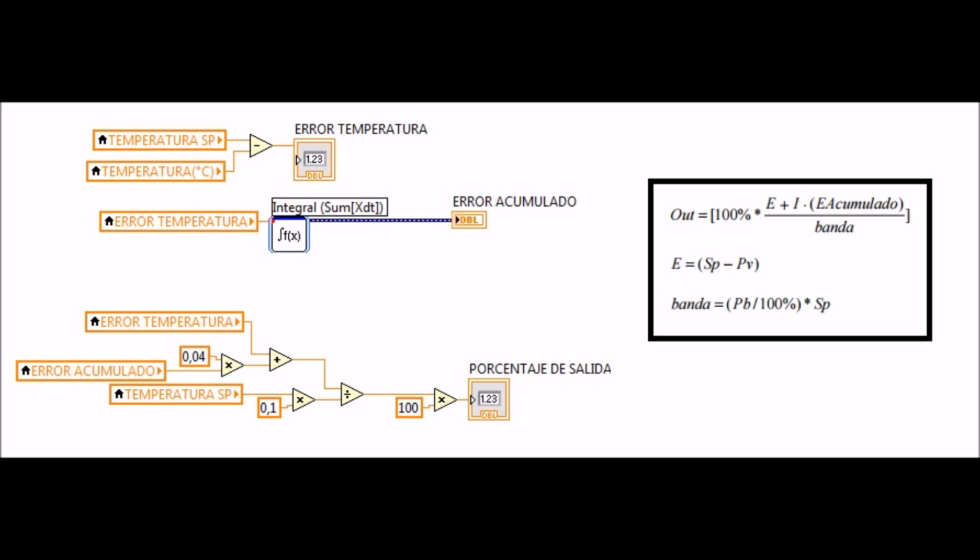PWM control is generated. If the variation is decreasing, the PWM decreases. When negative errors occur, the system responds by decreasing the PWM. So no on-off control is set, allowing the system to make a proportional change, controlled and not an abrupt one like the on-off. For the calculation of the error, the difference between the set point temperature and the temperature being read is used.